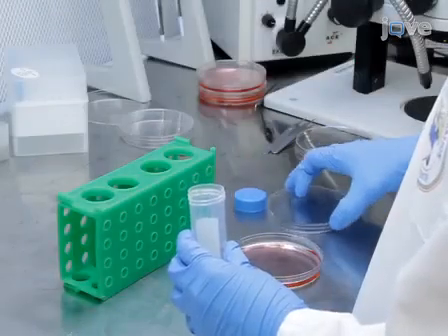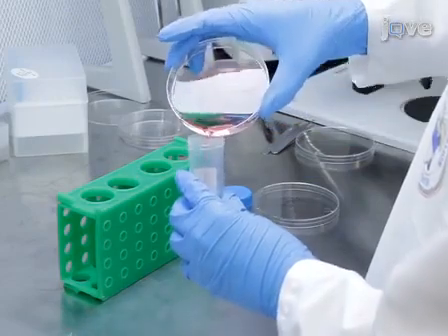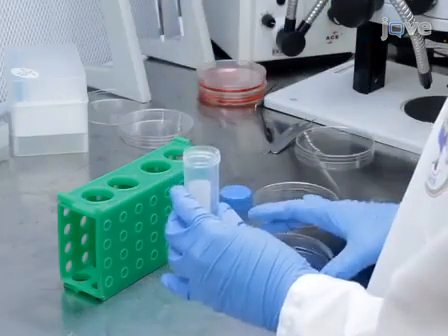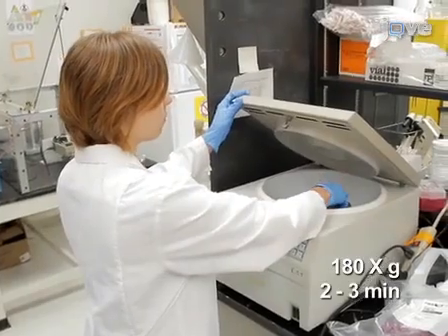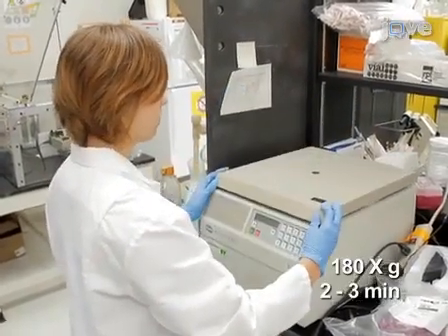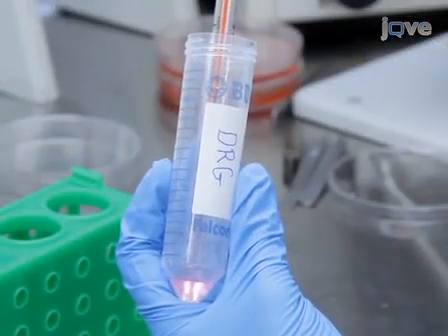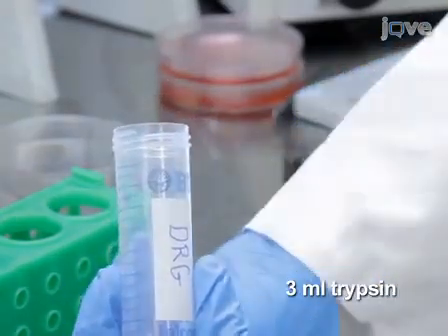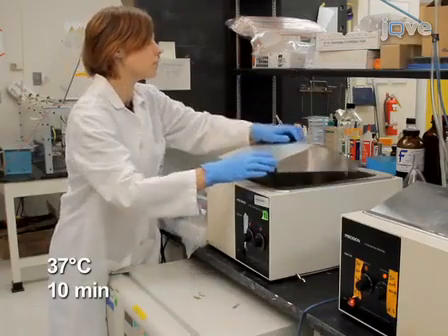To obtain sensory neuron cultures, begin by pouring the dorsal root ganglia removed from the spinal cords and L15 into a conical tube. Spin at 180 times gravity for 2 to 3 minutes to pellet the pieces. Following the centrifugation, pour off the supernatant and add 3 ml of trypsin to the pelleted DRG. Incubate in a 37°C water bath.